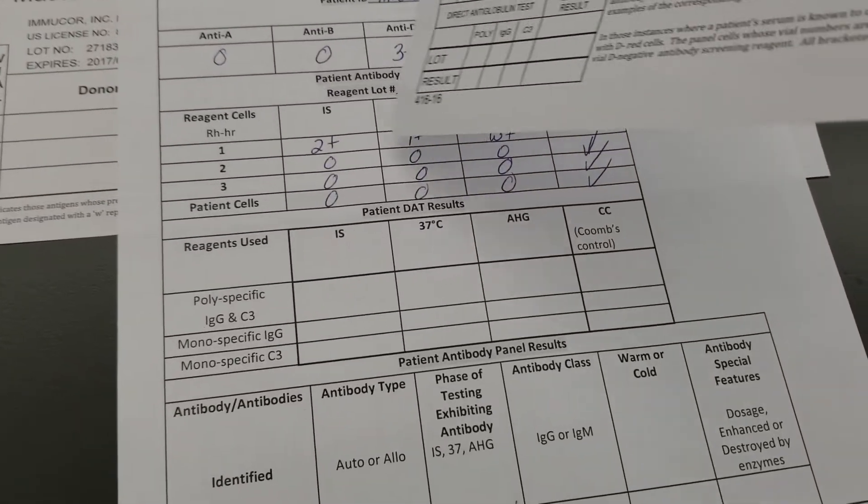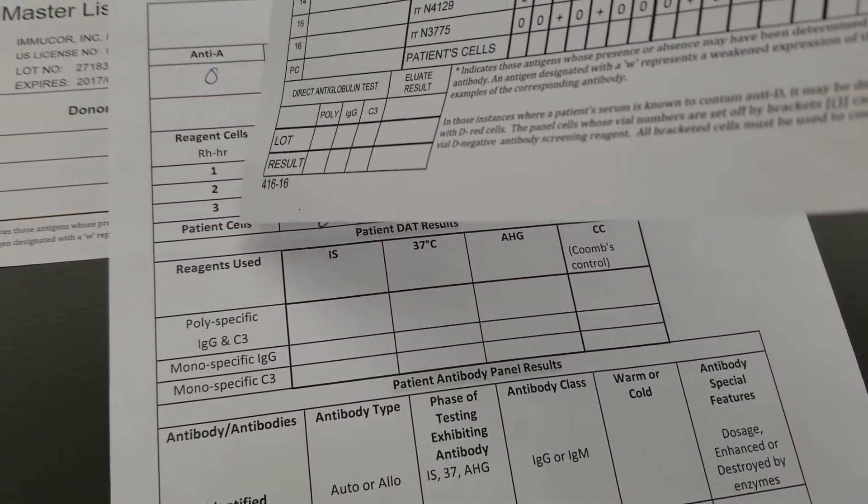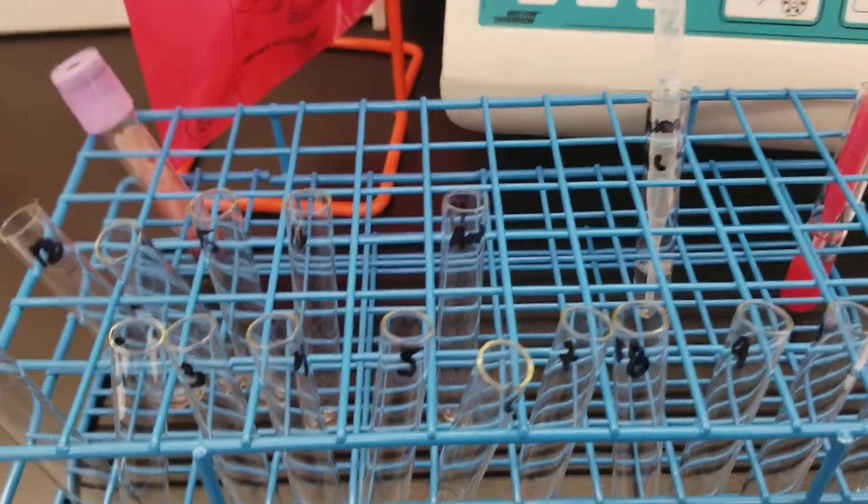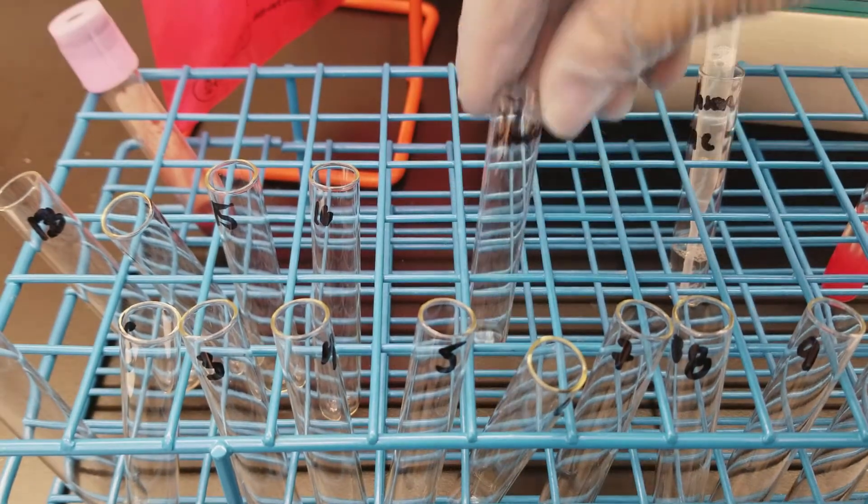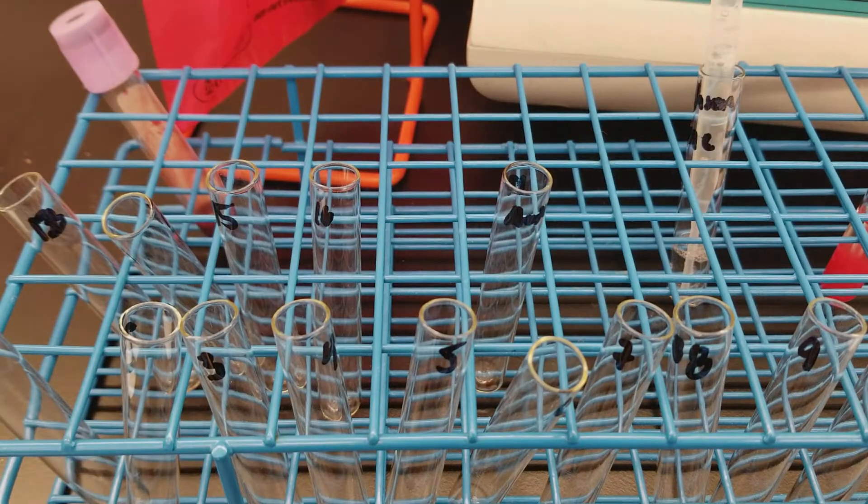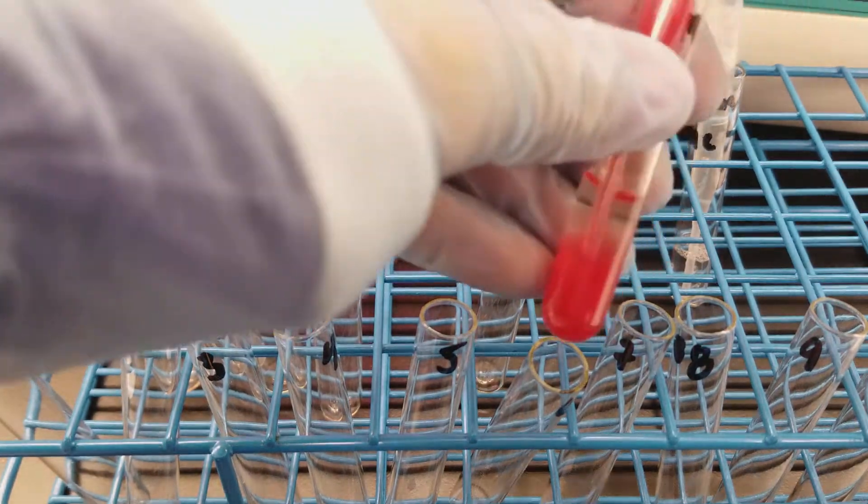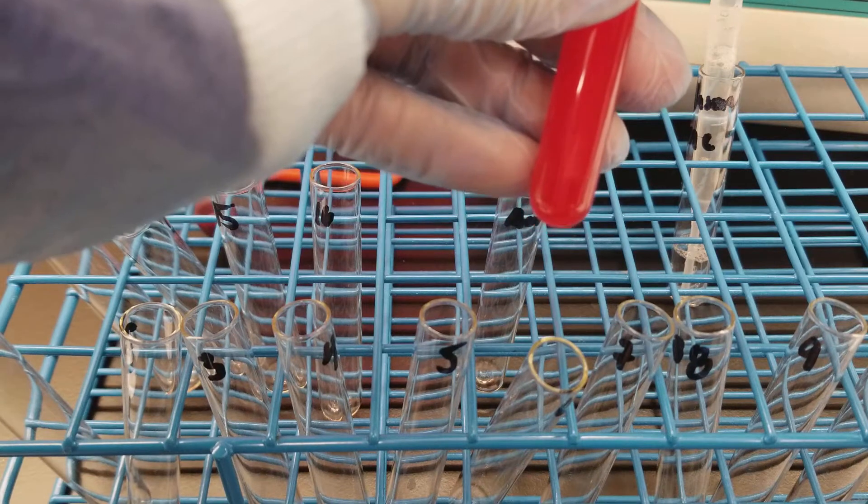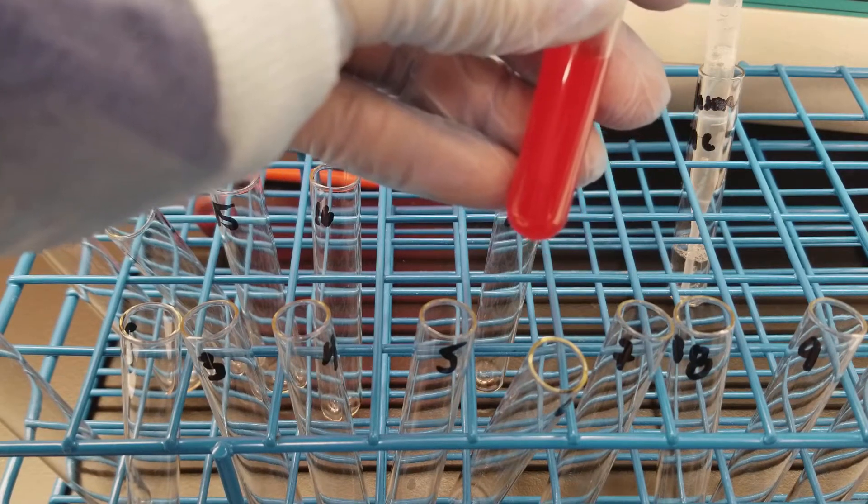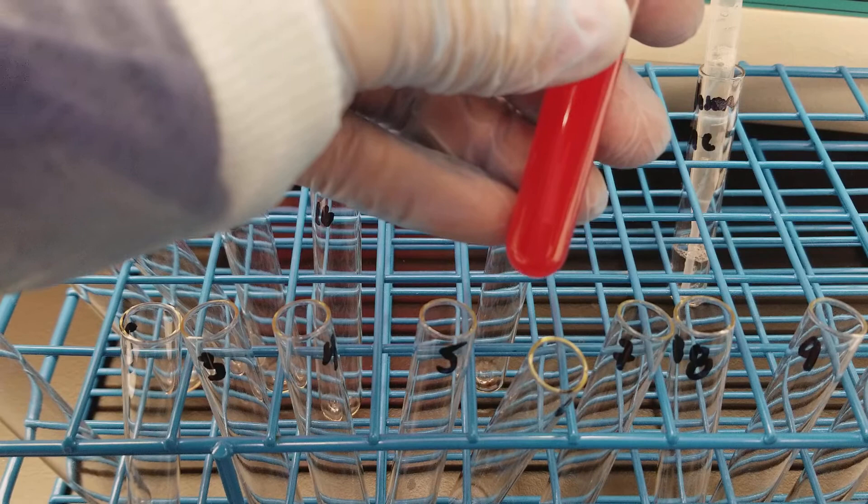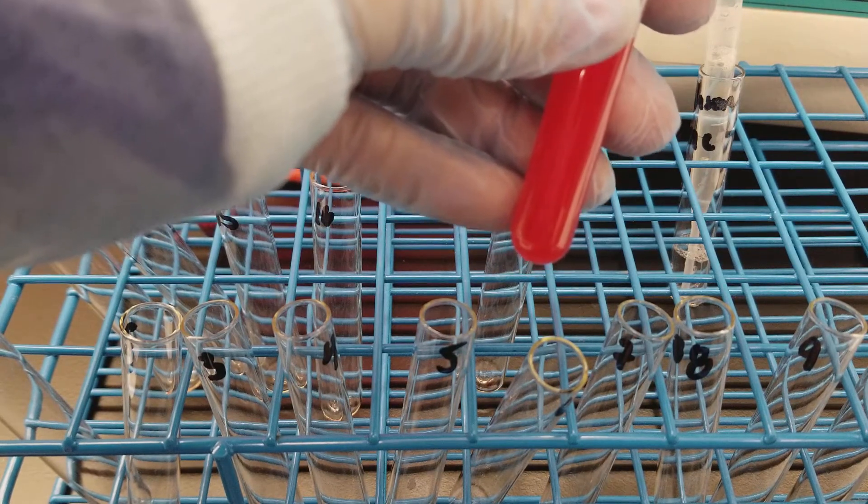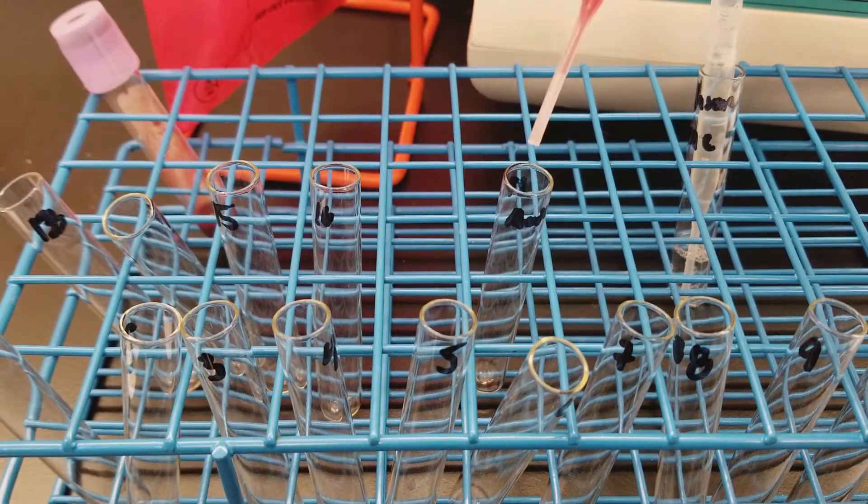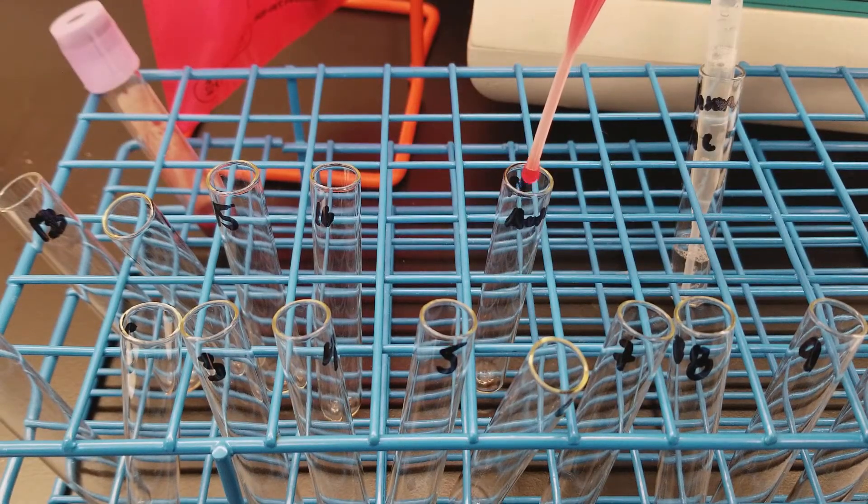All the other ones up here, the other line cells one, two, and three, are reagent cells. So we have 16 tubes and one auto control. Always make sure you put that auto control out there. I want to resuspend my three to five percent cellular suspension. I will be putting one drop of cells, whether the reagent or auto control cells, into the tubes appropriately. This is the auto control, so we're going to get one there.